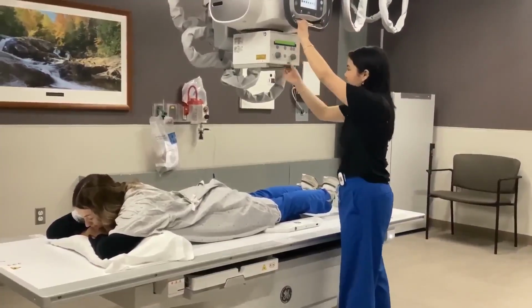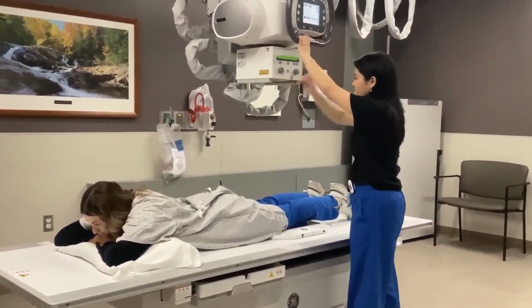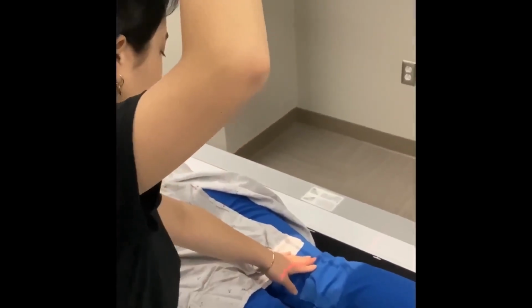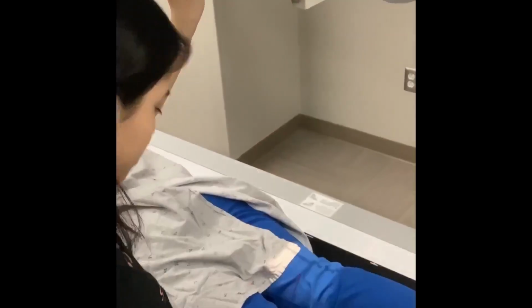We're going to be using an IR size of 8 by 10 inches placed portrait, and you'll ensure that there's a 40-inch SID. The patella is positioned parallel to the IR with no rotation of the knee, and the central ray is placed perpendicular and centered to the mid-patella, where you'll then mark the correct side of the body.